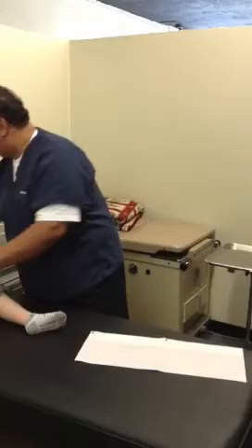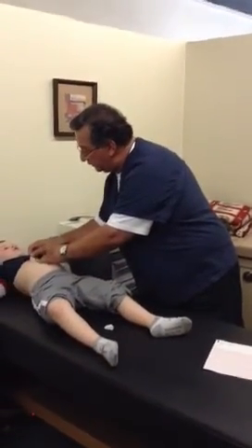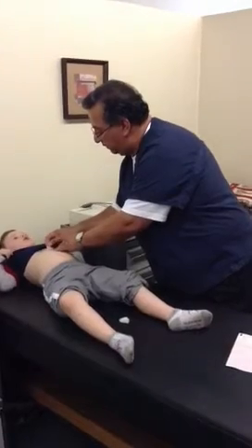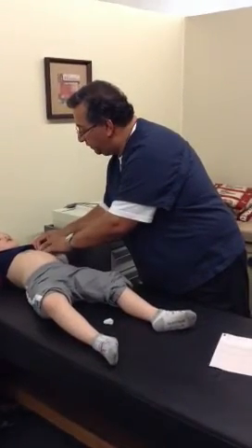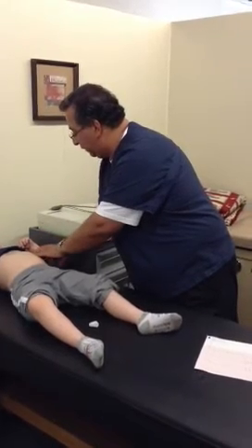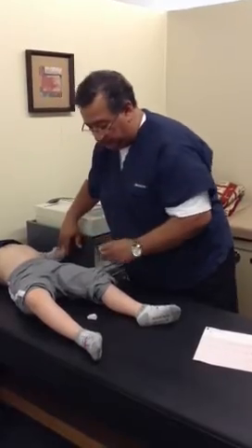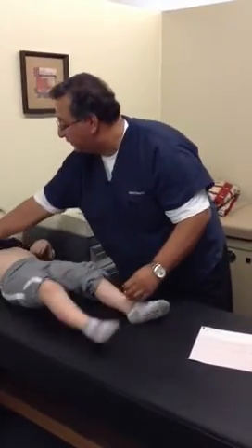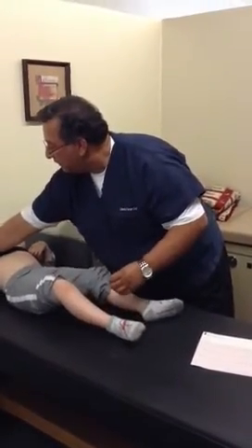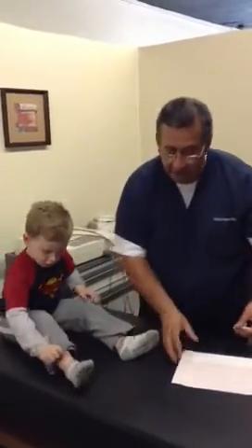So we're going to help you off the table. By the way, when you pull these electrodes off, they can hurt, so pull them off carefully. If the patient has hair on their chest, pull the electrodes off whenever possible with the grain of the hair growth, not against it, because that can pull hair off and that hurts — even on guys, that can be painful. Let's take this last one off. Thank you very much. Let's pull your shirt down.